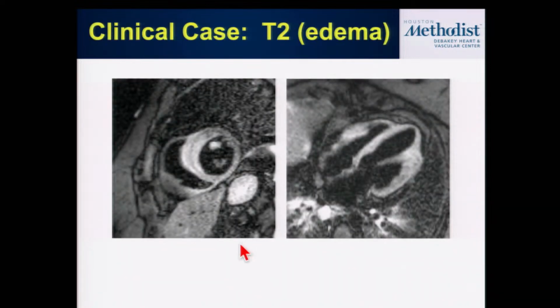If we pair this with the ability to do T2-weighted imaging, either with T2 spin echo or T2 mapping, you can see that there's high signal in those 3 locations as well on our T2-weighted imaging, suggesting increased water content and telling you that this myocardial damage that we're seeing based on LGE is not chronic, but is rather acute.